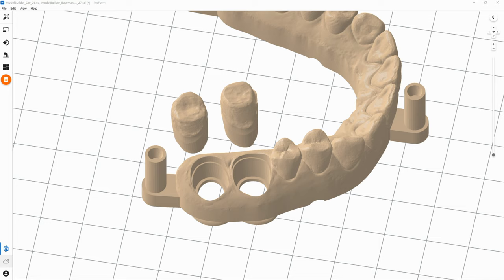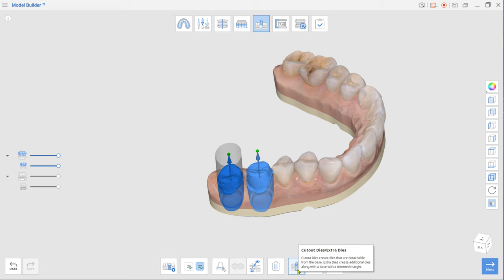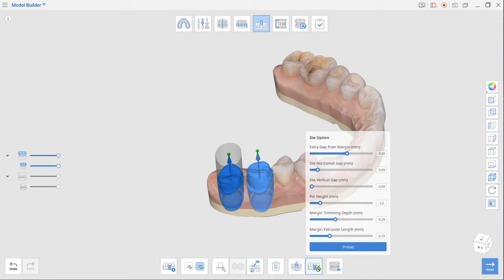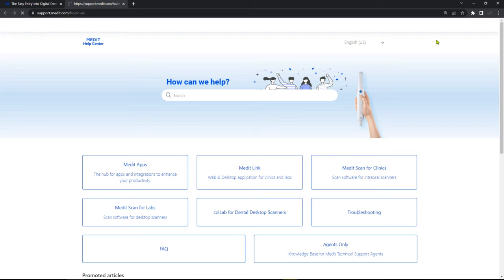To create detachable dies, make sure Cut Out Dies is selected in the toolbox. Finally, adjust parameters for the die fit using Die Option. To have the best result when printing with your specific 3D printer, check out our partners' recommended parameters in Medit Help Center.